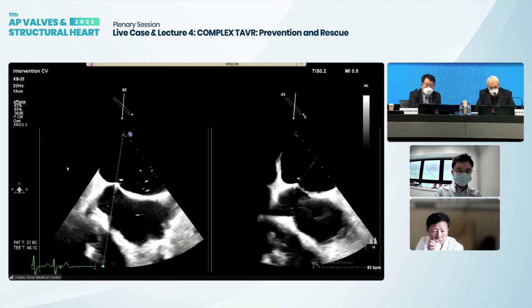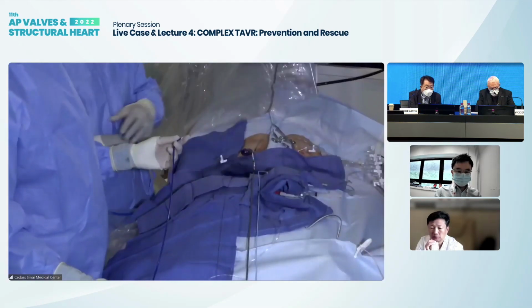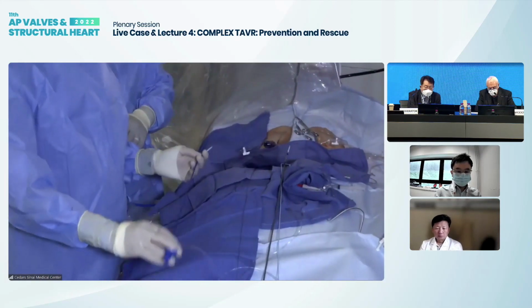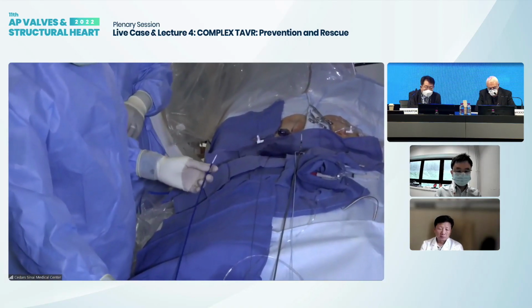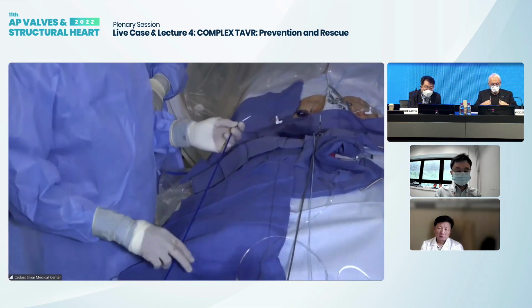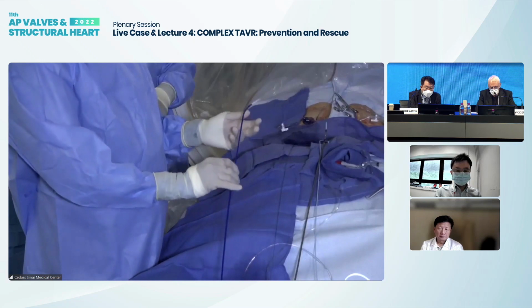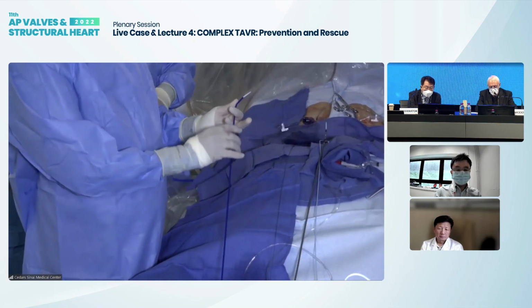Okay, terrific. So what we want to show is, I don't know how many people are familiar with or how much the Baylis VersaCross system is actually in use. So this is our go-to transseptal system. Essentially, you can shape this.